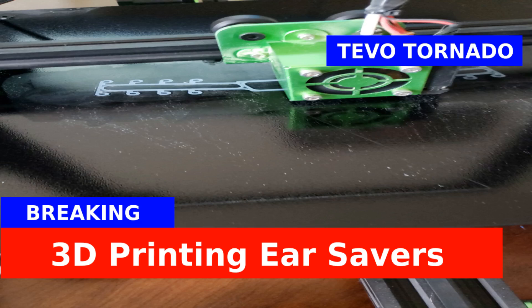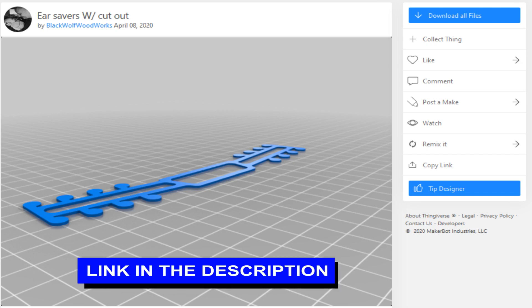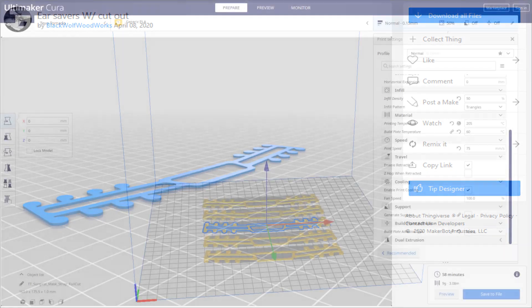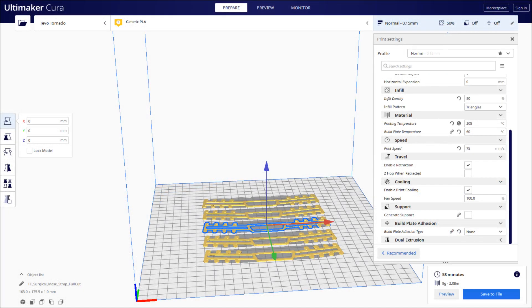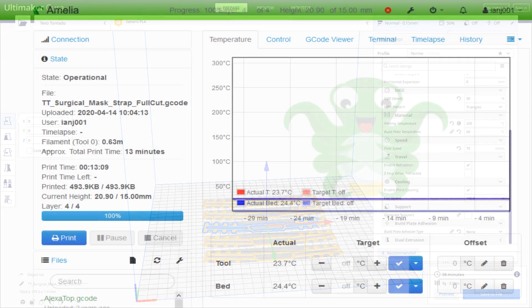I saw on Mastodon that some people were printing these ear savers, and at first I didn't even know what an ear saver was — never seen one before. So I asked my wife about it and she explained that it's to prevent the elastic on the mask ripping a hole in your ears if you wear the mask too often. So I thought it'd be a good idea to take a look and see if we can make some ourselves.